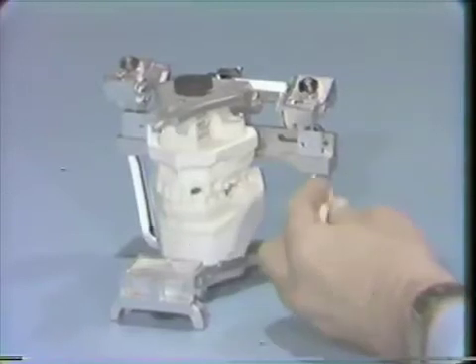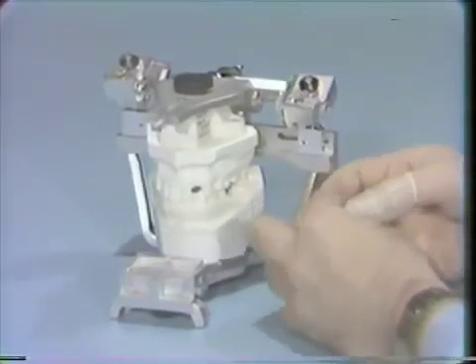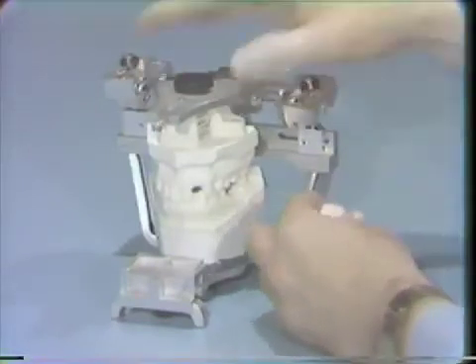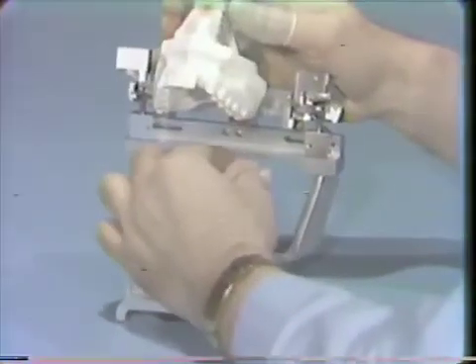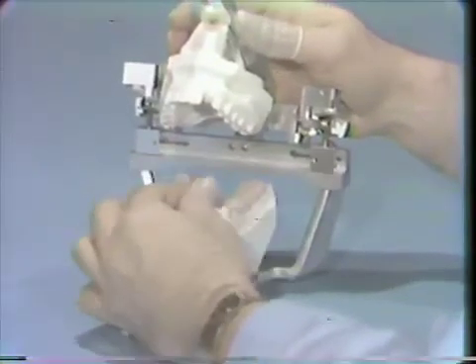We don't need too terribly much of the material, and place it over the teeth and mold it to shape with our fingers. And you can see that much of the memory that's normally found in the acrylic materials is absent with this particular acrylic, and instruct our patient to close into centric occlusion.